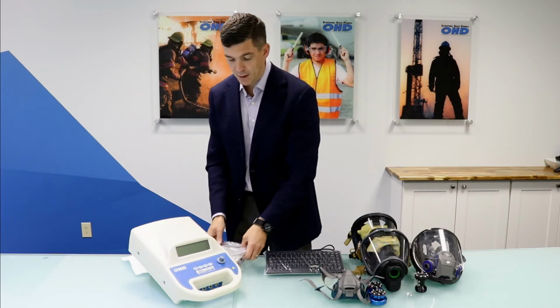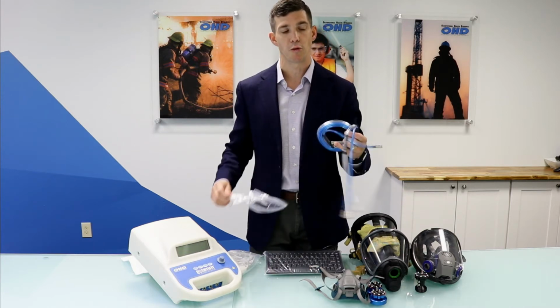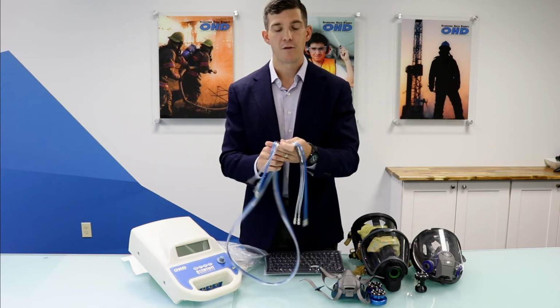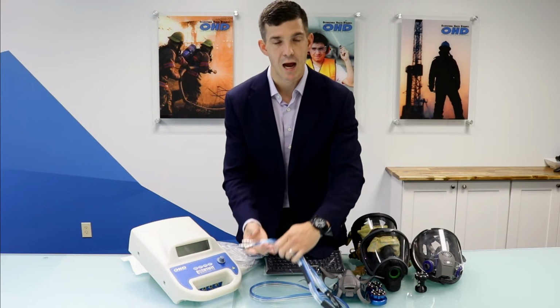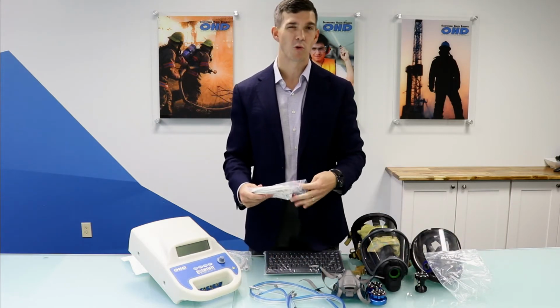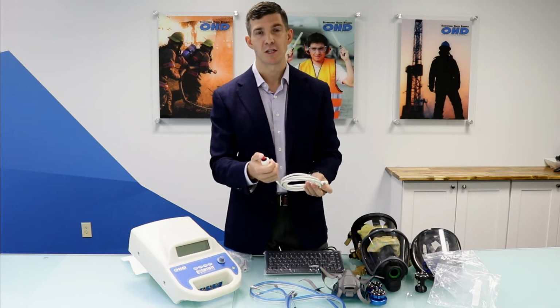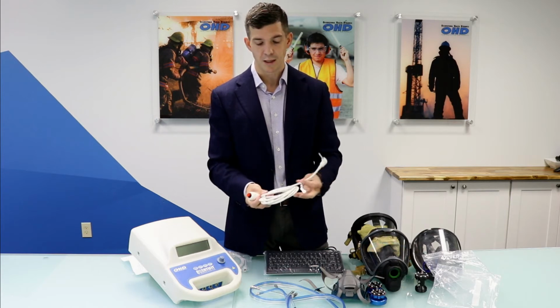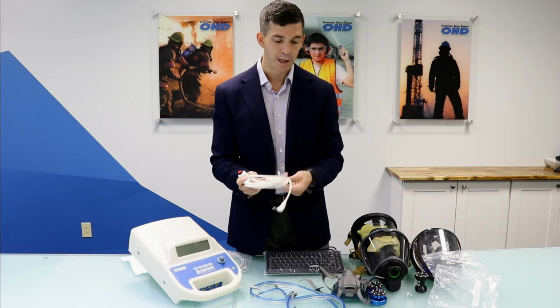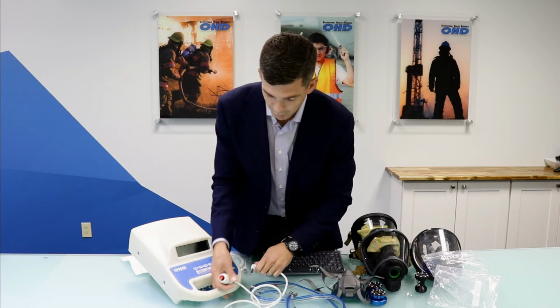So once that's in, the other components that you'll have would be your triple tube assembly, which we'll walk you through in just a second for fit testing. This is where we'll pull the air out of the respirator and challenge the mask with that breathing rate. The second component is going to be a start switch, or what we call a trigger button. Really, if you've ever done an audiometric test, it's very similar. Just a button that starts and engages the test, and that comes out of your case. Some people will keep the twist ties. I like to normally take them off and throw them away. But that plugs up right in the front.